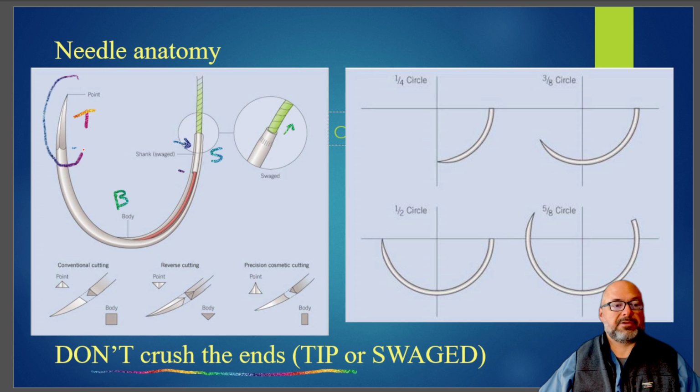And if you grab up here at the tip of the needle, especially as you're working it back and forth to bring it out of the tissue, grabbing the tip of the needle can absolutely dull the tip considerably, so it's harder to pass through tissue, maybe doing a little bit more tissue damage as it goes through. But also, if you bend the tip of the needle one too many times, the tip will actually break off. I've seen that happen a handful of times.